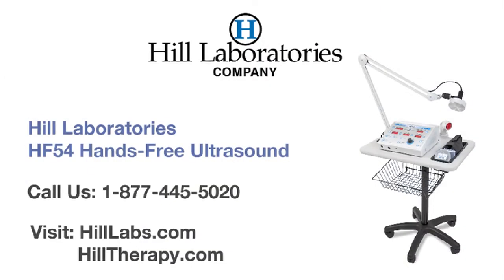The HF54 hands-free ultrasound with interferential and pre-mod current offers a safe and effective treatment while increasing your patient outcomes and saving you valuable staff time. Hill Laboratories has been a leading manufacturer of chiropractic, physical therapy, and medical treatment tables since 1945. For questions and ordering, call us toll-free at 1-877-445-5020 or visit hilllabs.com.